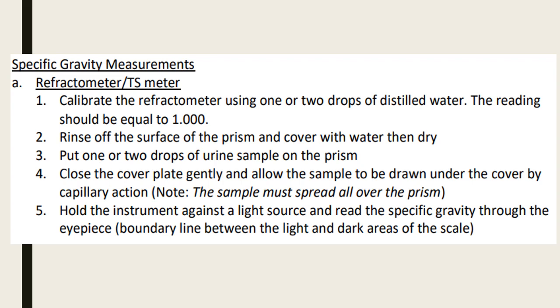Comparing it to osmolarity, when you say osmolarity, it is only dependent on the number of particles only. Your specific gravity is an indicator of the concentration of dissolved materials in your urine. As such, you have your specific gravity measurements.